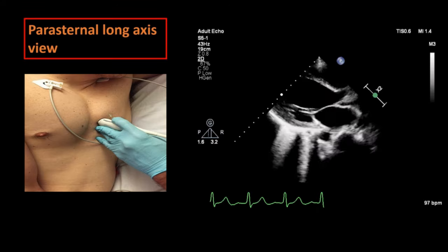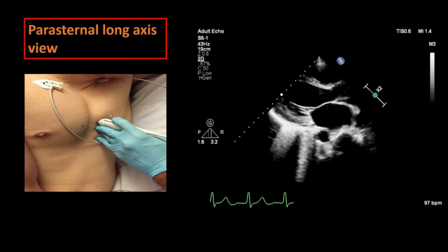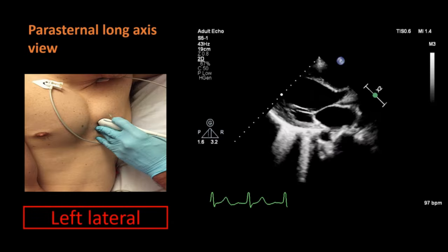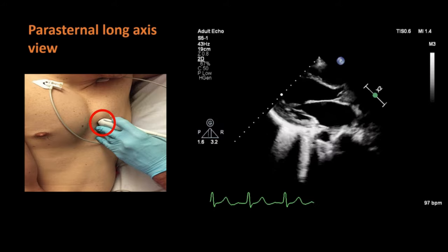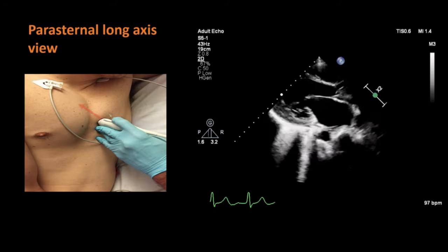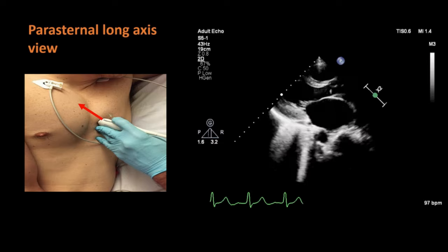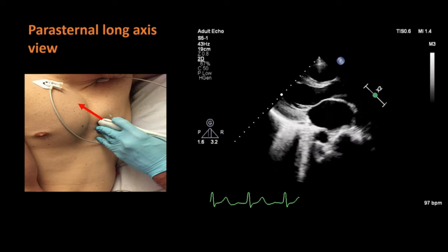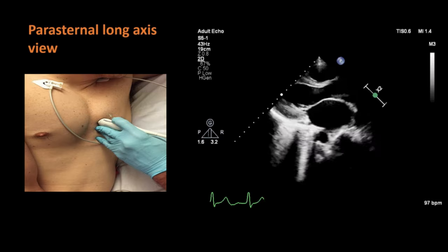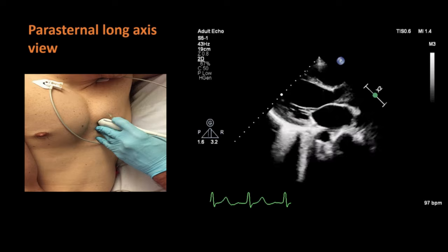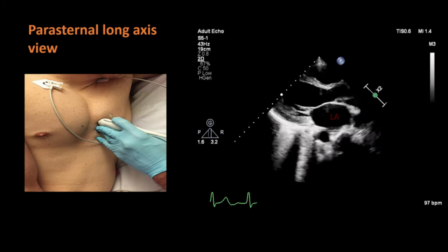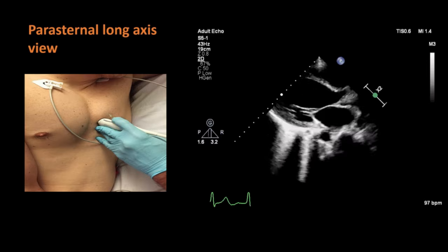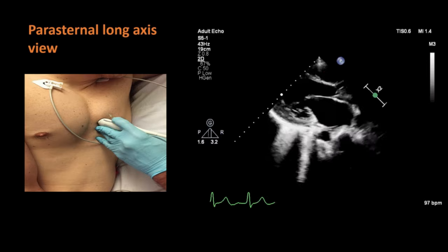This is the parasternal long axis view of the heart. You can see the patient is in left lateral position. The probe is placed in the third intercostal space and the direction of the orientation marker is towards the right shoulder of the patient. In the parasternal long axis view we can see the left atrium, left ventricle, right ventricle, and the aortic root.